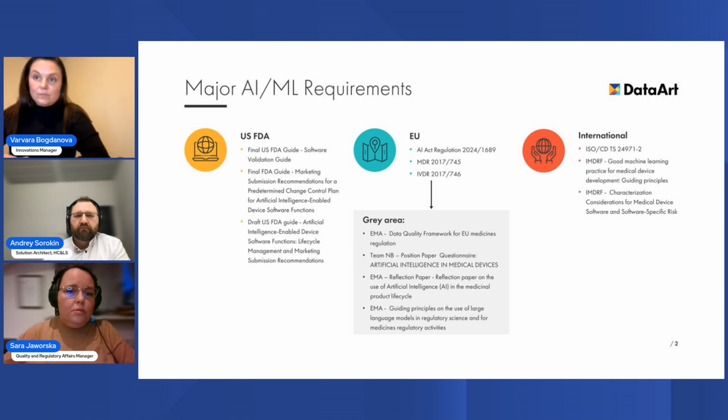Just a small note that so far the FDA has already cleared hundreds of AI-powered medical devices. Still, we do not have such data for the EU because the EUDAMED database is not operating to this extent. But the experience that regulatory bodies have gained so far contributed to shaping the new requirements.